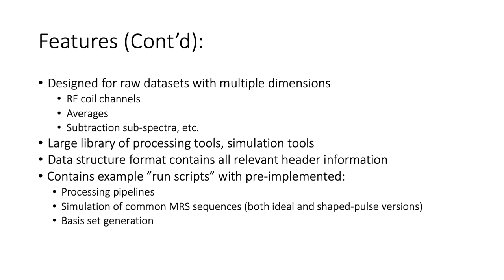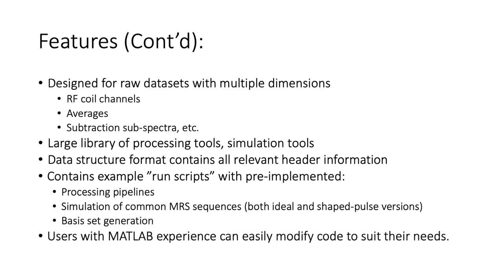There's also a library of run scripts, which has pre-implemented processing pipelines and simulation pipelines, as well as tools for generating basis sets. And lastly, because it's all coded in MATLAB and it's open source, users who have experience with MATLAB can easily modify the code to suit their needs.